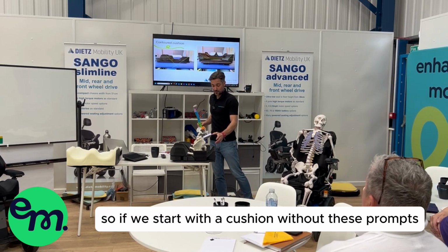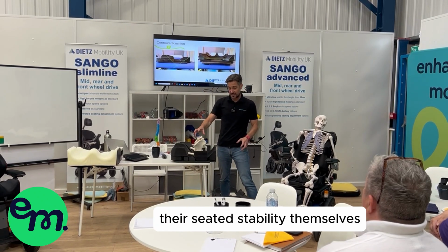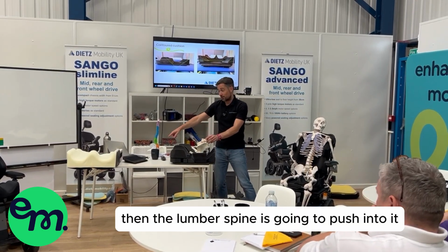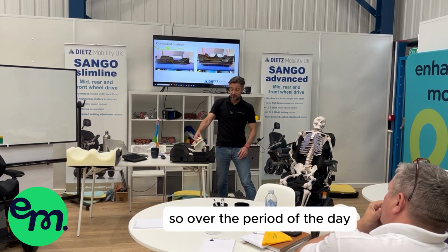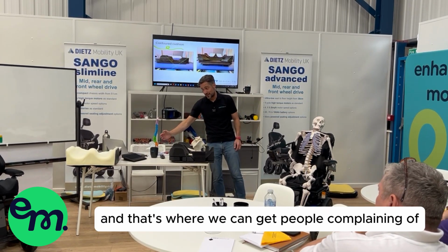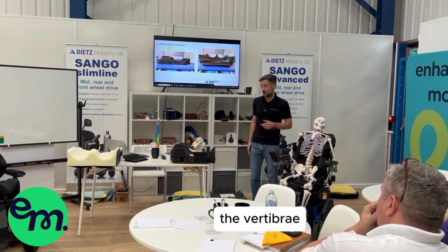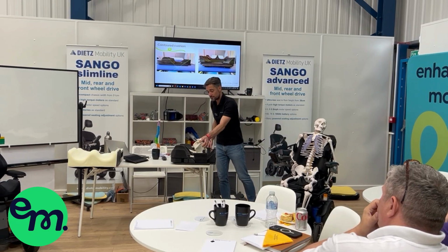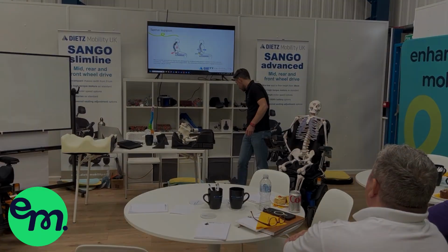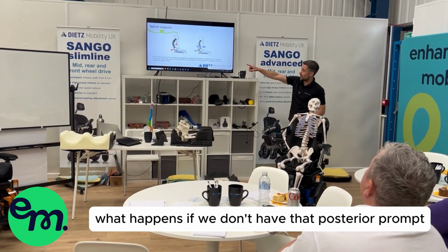So if we start with a cushion without these prompts, and the person cannot maintain their seated stability themselves, you're going to start to rock back. And if your backrest is flat, then the lumbar spine is going to push into it. So over the period of the day, or however long someone's going to be sitting in the seat, you're going to flatten your lumbar curve, and that's where we can get people complaining of lower back pain because the vertebrae are not in the position that they want them to be in. And again, that's why it's so important that we have that pelvic stability. But that's just a nice little example of what happens if we don't have that posterior prompt.